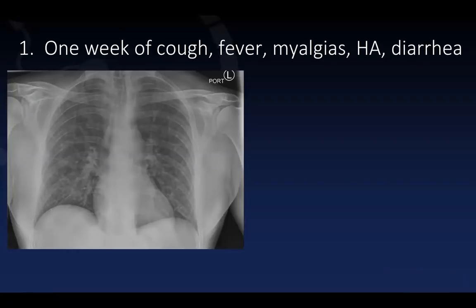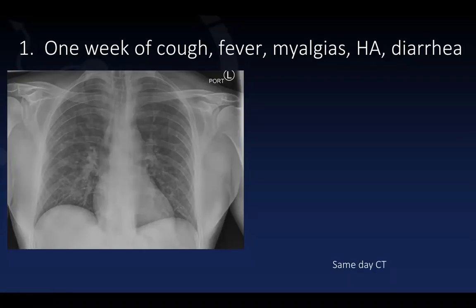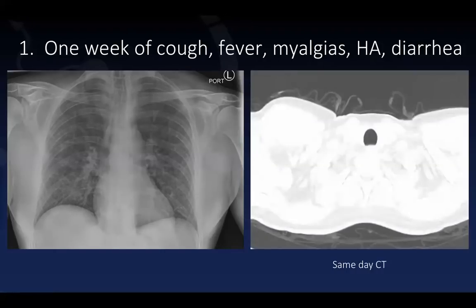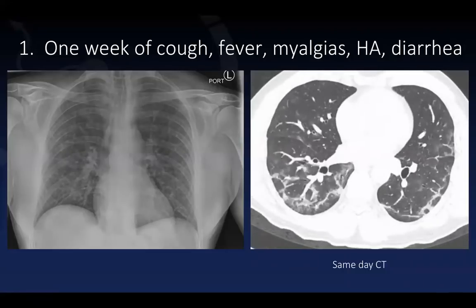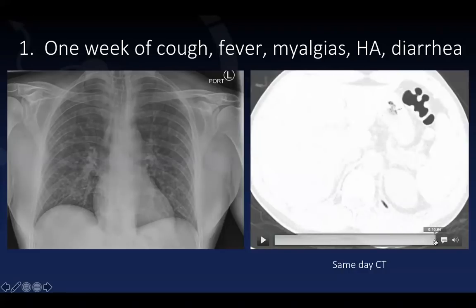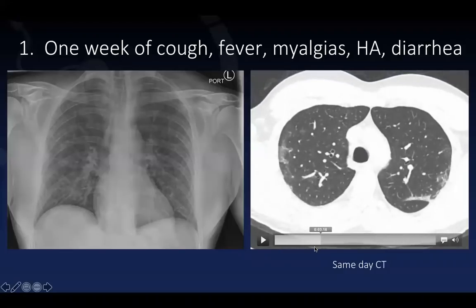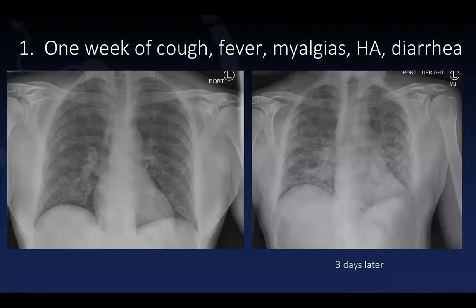This is one of our patients with one week of cough, fever, myalgia, headache, and diarrhea. The presentation chest x-ray can be called normal on a quick look — there are probably subtle findings of increased interstitial markings in the right lung but difficult to say definitively. The same-day CT shows areas of peripheral ground glass, patchy and with more consolidative areas, somewhat more predominant in the dependent aspect of the lung. Radiographic progression three days later makes it very clear there are abnormalities in the lungs.